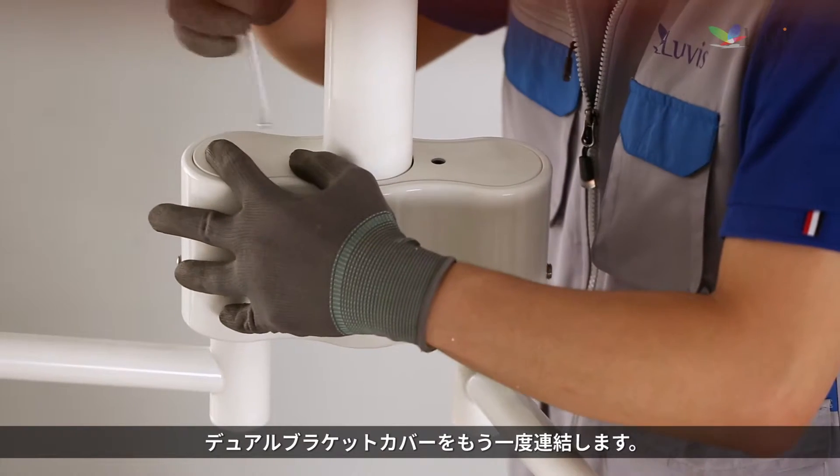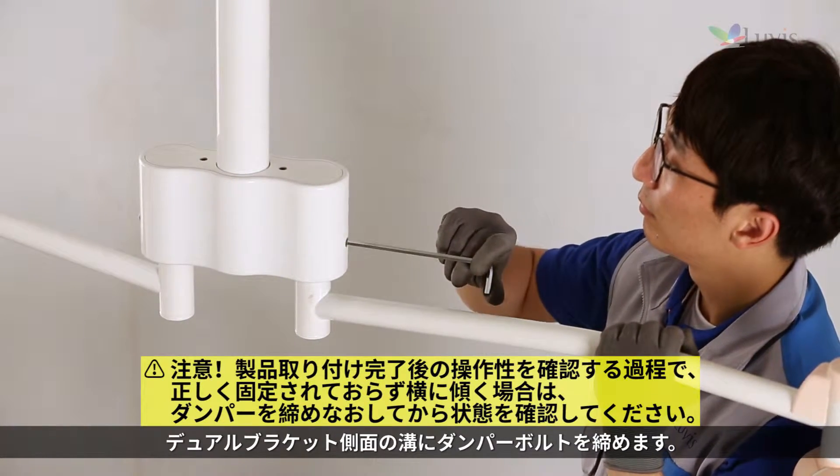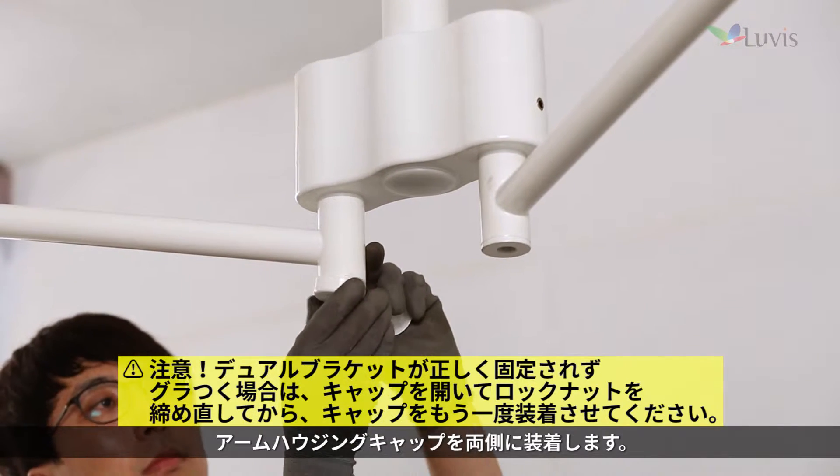Reattach the dual bracket cover. Attach the damper bolt to the hole on the dual bracket side. Attach the arm housing cap to both sides.